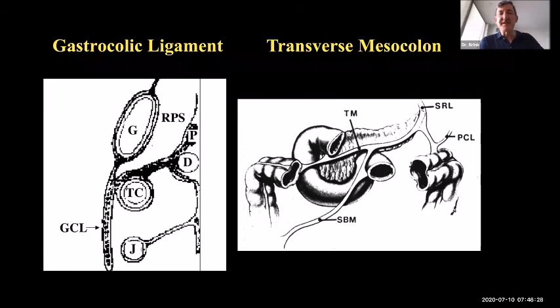I do typically cover some internal hernias, but maybe in a very cursory sense. What you're really looking for is loops of bowel that are not where you expect them to be. And if you see a cluster of bowel that does not look like it normally does in all the other patients you look at, that it's loculated or seems like there's a wall around it, or it's in a sac of some kind, this is often a tip that you're dealing with an internal hernia. I'd be very happy to go on at some length about this at another time.